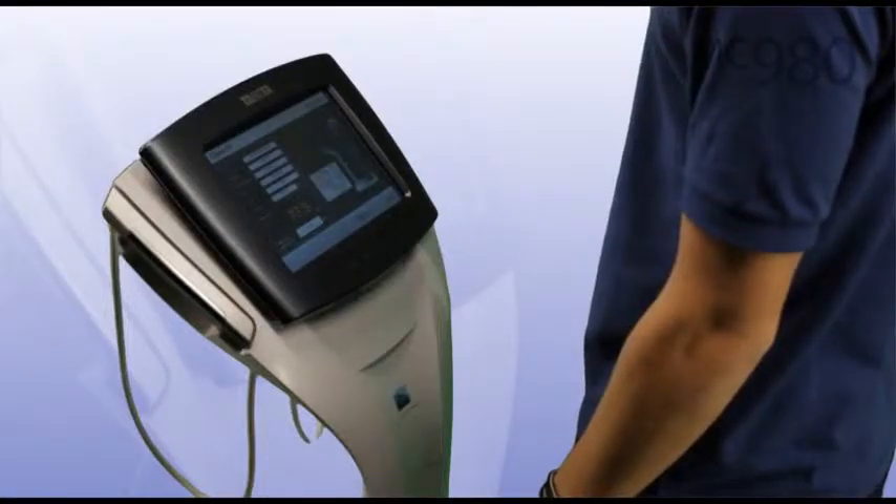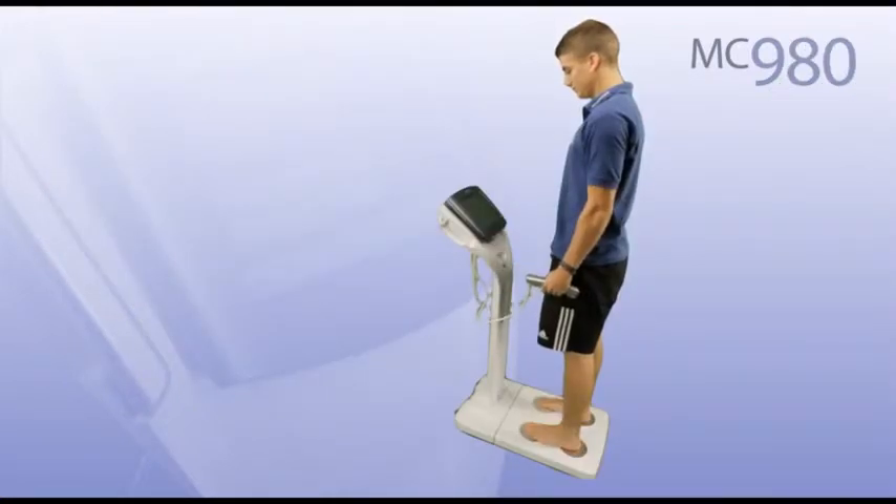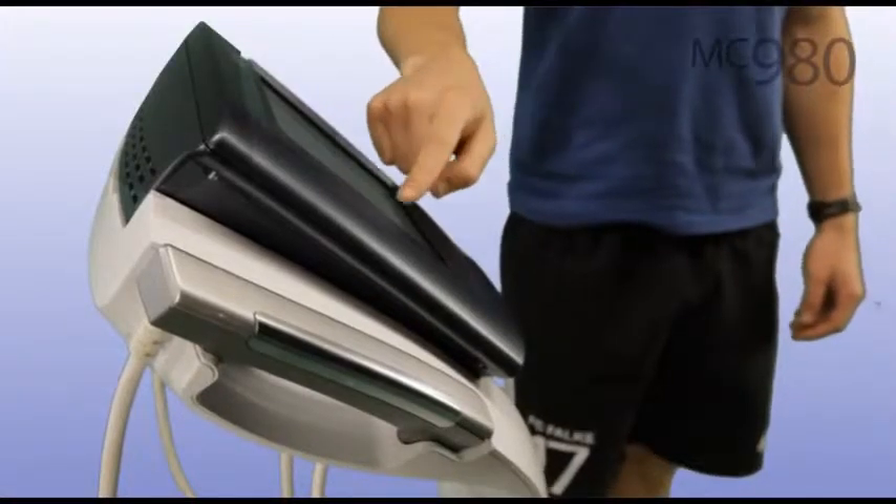Stand barefoot on the four footplates. A weight measurement is taken. Then take hold of the four hand electrodes to complete the body composition analysis. The interactive touch screen display then takes users through their readings, step by step.